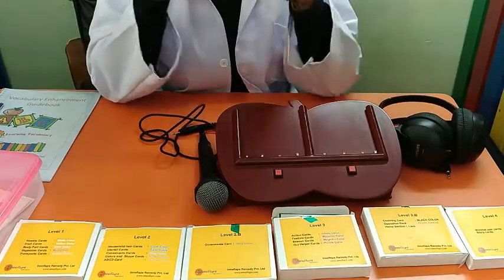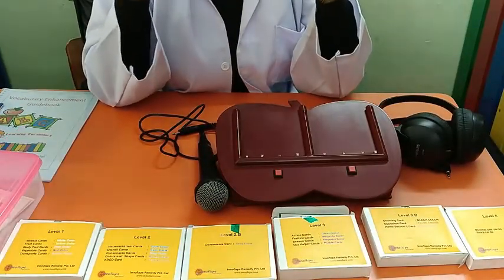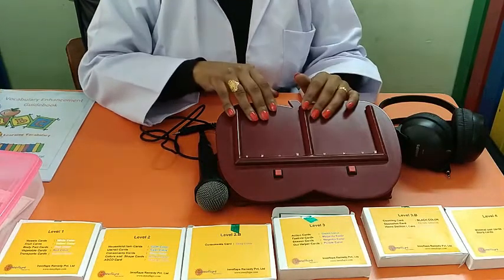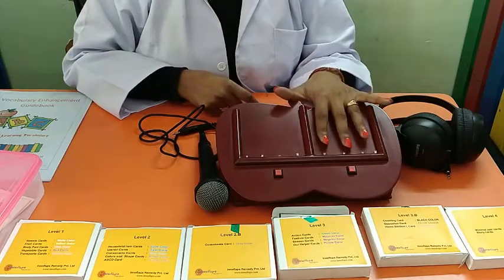Any kind of disorder may have a component of delayed speech and language. For their speedy development, we have designed this Speechify device.